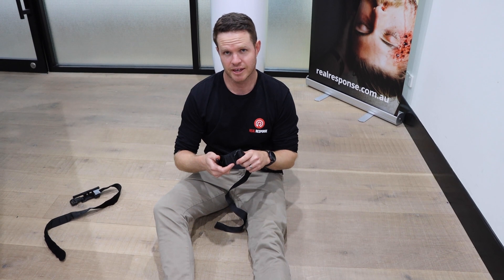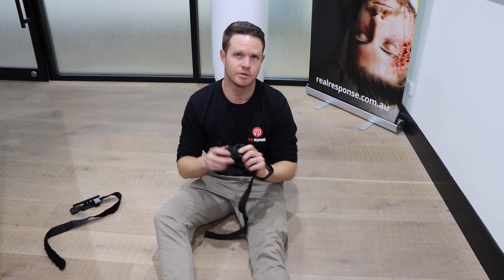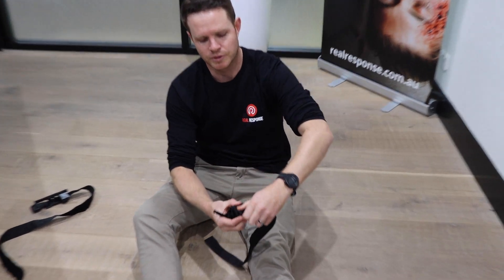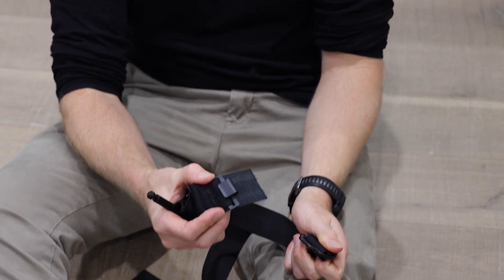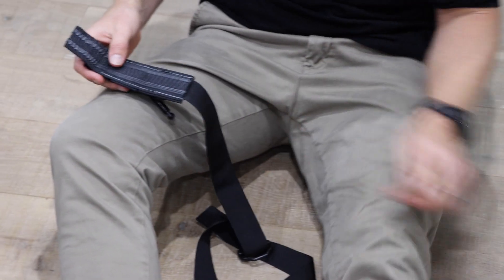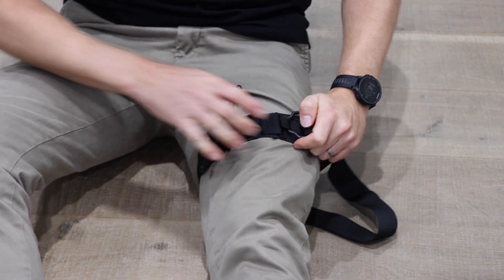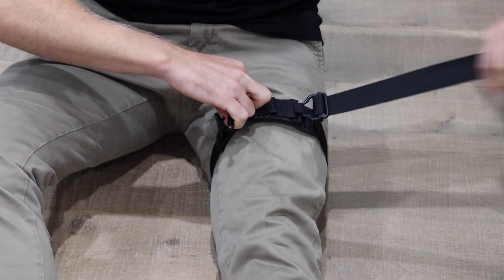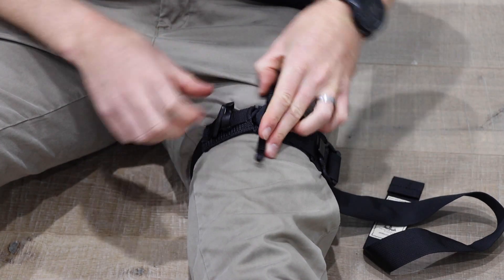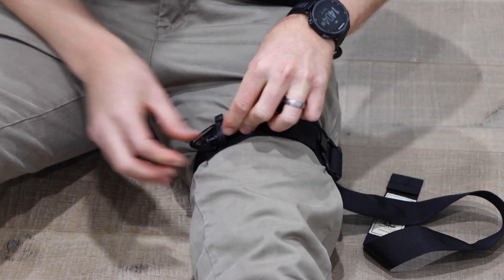When applying the SOF-T to the leg, the same principles apply. To get the buckle off, don't rip it - fold it back on itself and twist it out of the clip. From there, the same principle applies: pressure bar or the base of the material facing uppermost. Slide it underneath the leg, reach it around, lock it onto the clip, grasp that windlass like a lawnmower, grasp the tail, and pull it down as tight as possible, twisting the bar.